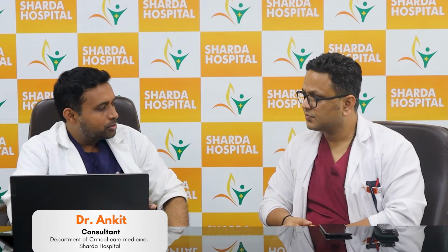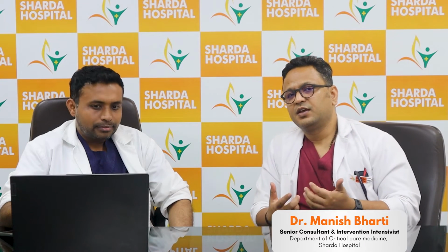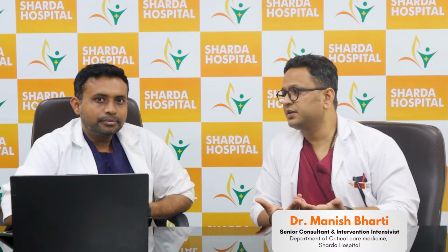So is it helpful in diagnosing? As you told, it's a well-known entity for therapeutic purpose. So can we use it for diagnosis purpose also? Oh yes. In fact, Dr. Ankit, if you ask me, 50% of the cases when you are dealing with them for the bronchoscopy, they are for diagnostic reasons.